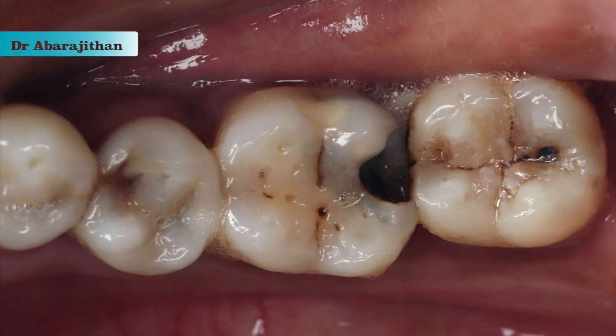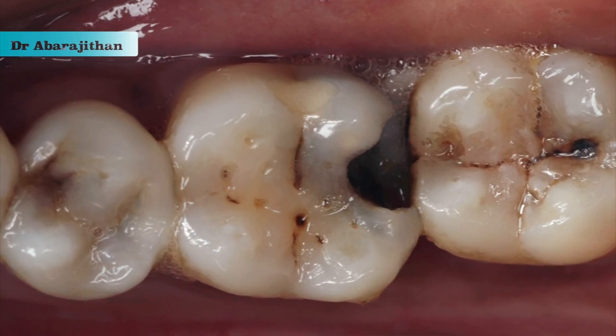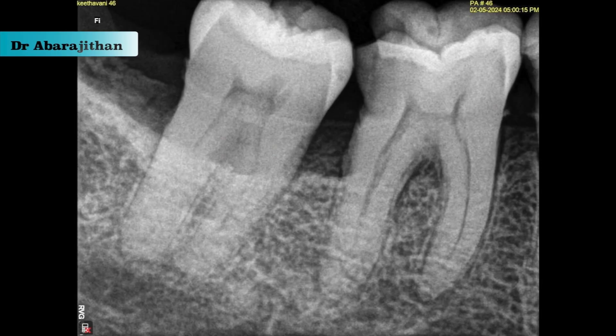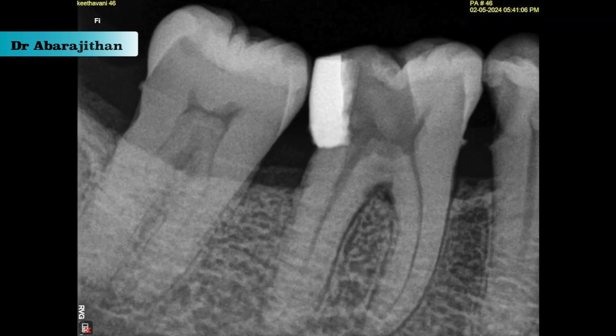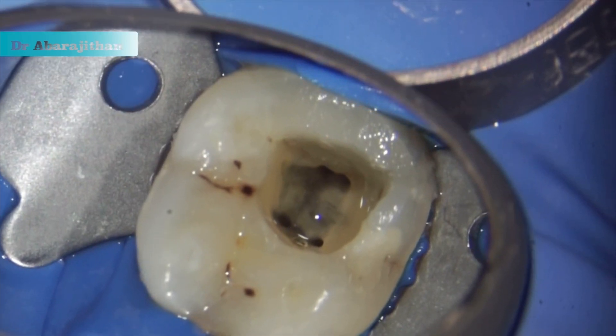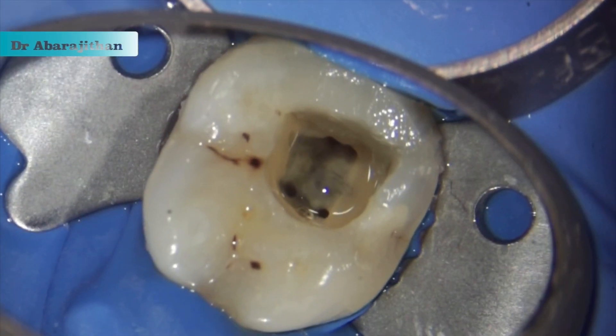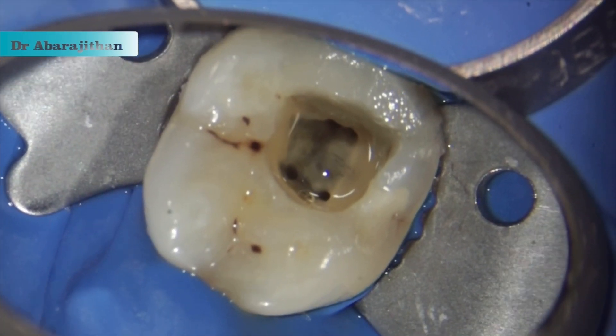Hello friends, I am sharing an interesting case with a few clinical tips of a mandibular first molar with disto-proximal caries and pulpitis. We begin the endodontic treatment with a pre-endodontic buildup to ensure adequate isolation and a predictable outcome.